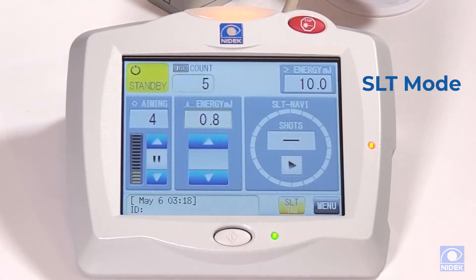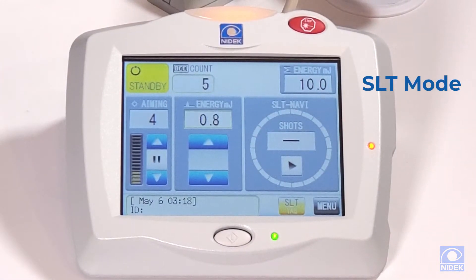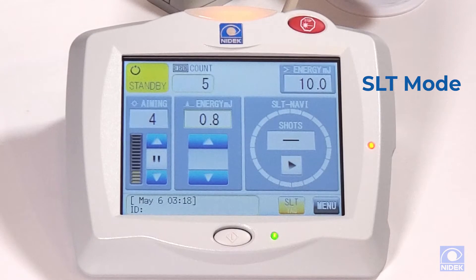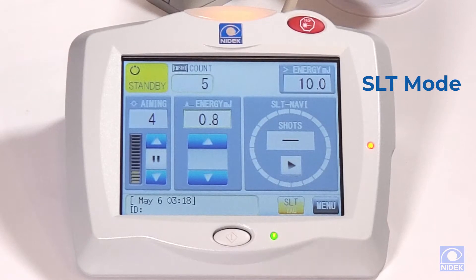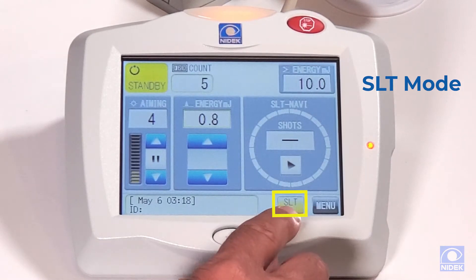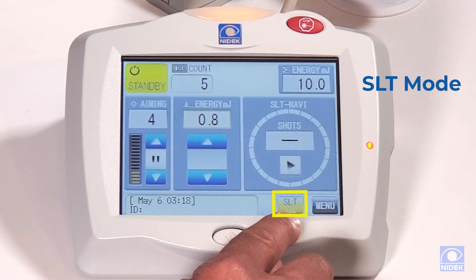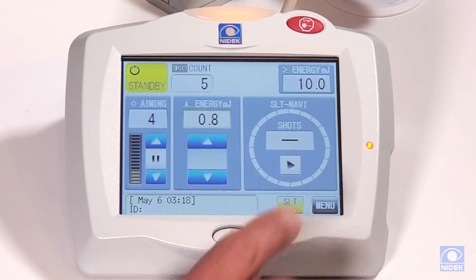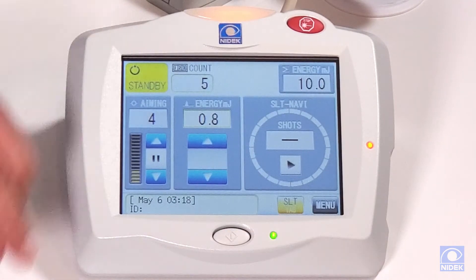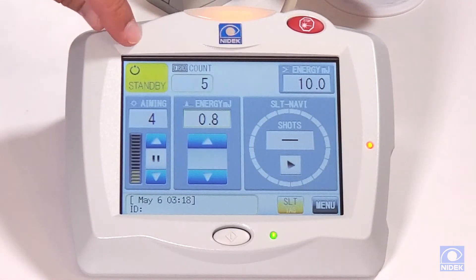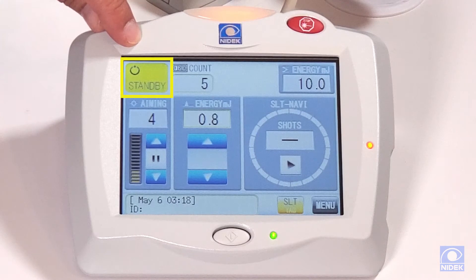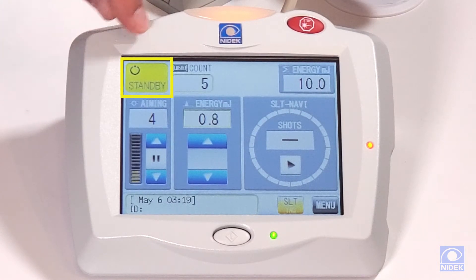I'm going to show you how to set up your treatment parameters in SLT mode. As you can see, we're already in SLT mode. We can transition back to YAG mode from this tab as well. By selecting standby, we go into ready mode, which will allow us to start our treatment.